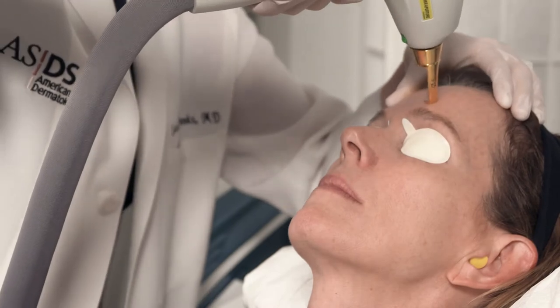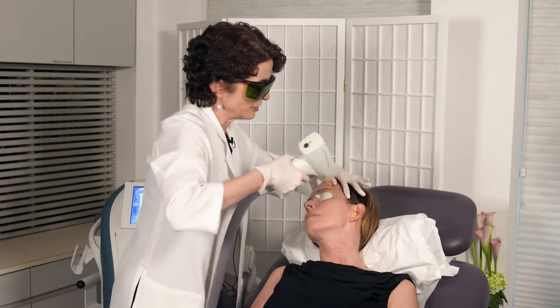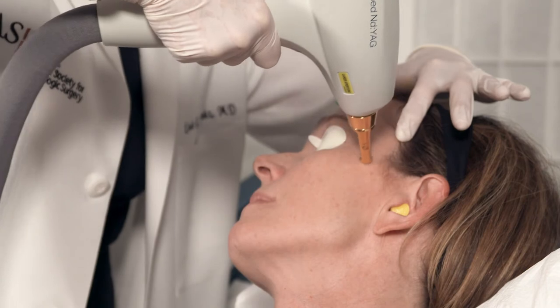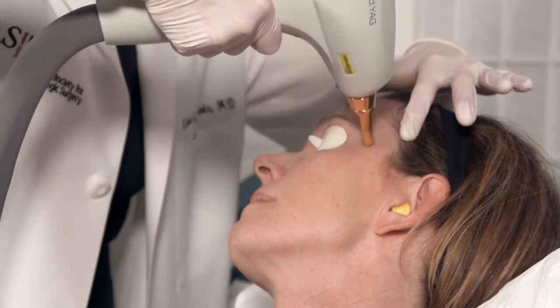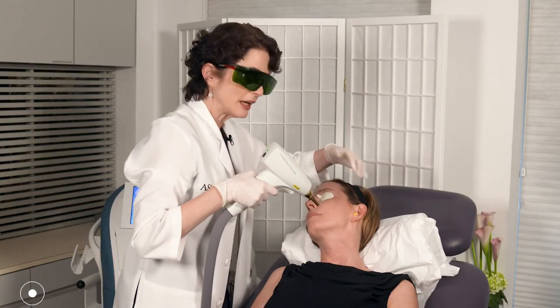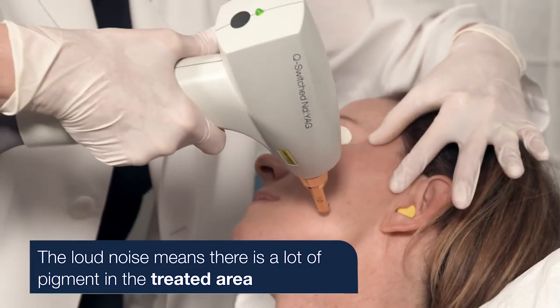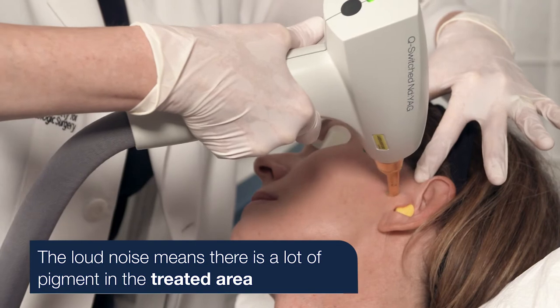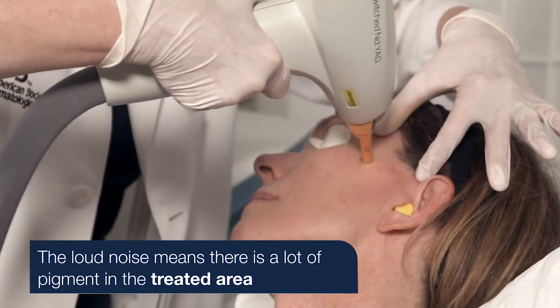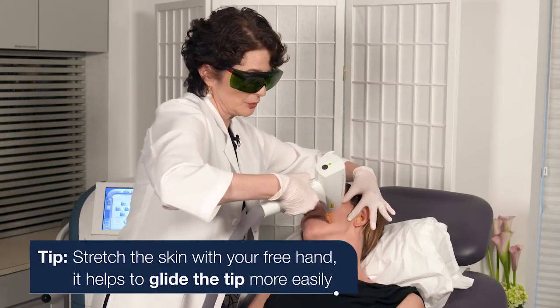Now we're going to go over to the forehead. Because we've had two prior treatments, we're not hearing as much popping. I'm going to come down and do the crow's feet area — you can hear that loud noise because this is where she has a lot of lateral photo damage. It's like the Fourth of July. I like to stretch the skin a little bit taut.